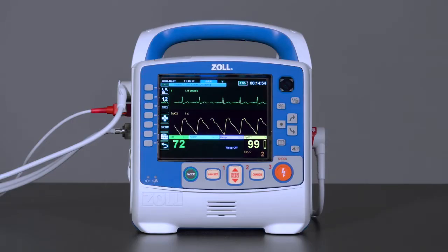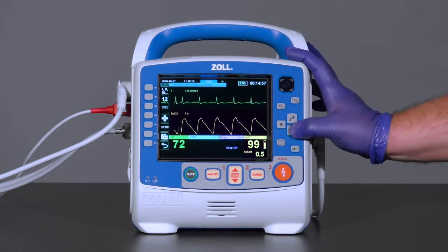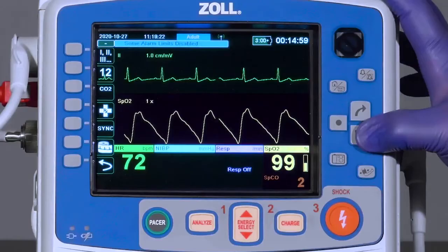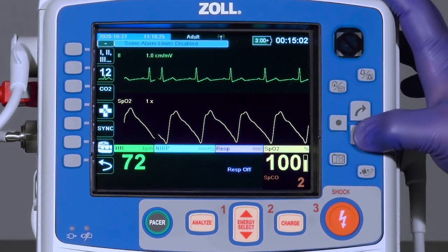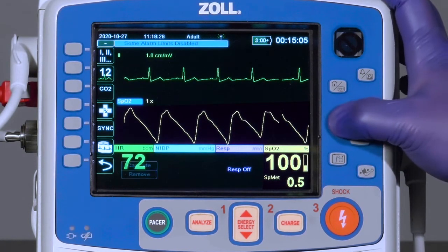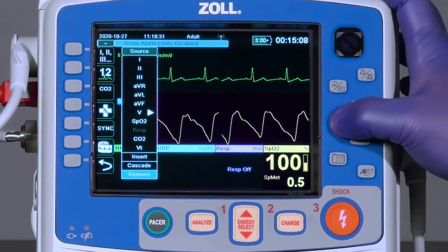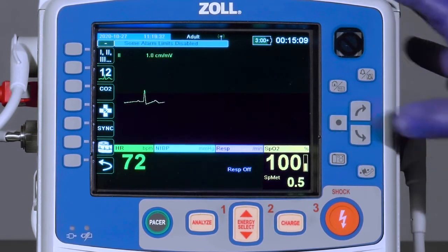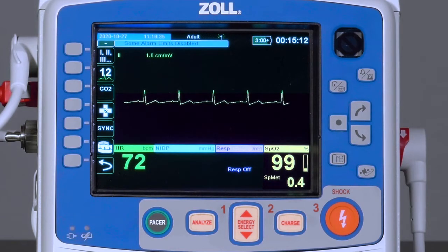Waveforms can be removed from the screen. With the exception of the top ECG tracing, any waveform can be removed from the screen by highlighting its label, pressing the select button, choosing remove, and pressing the select button again. The waveform is now removed from the screen.